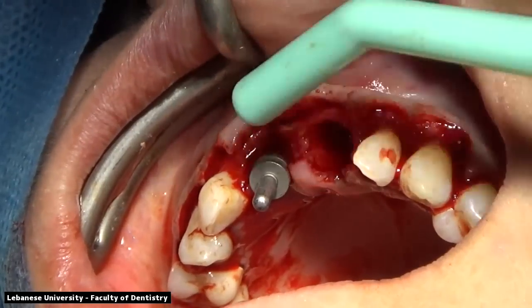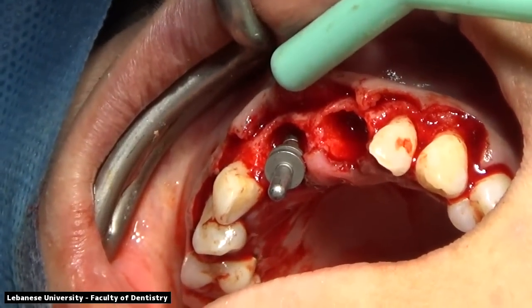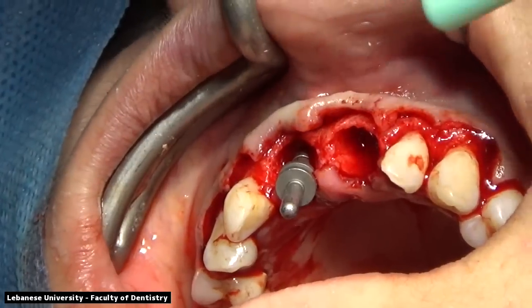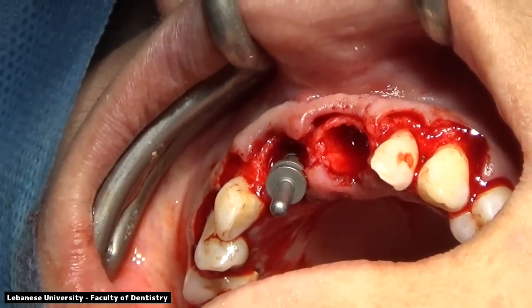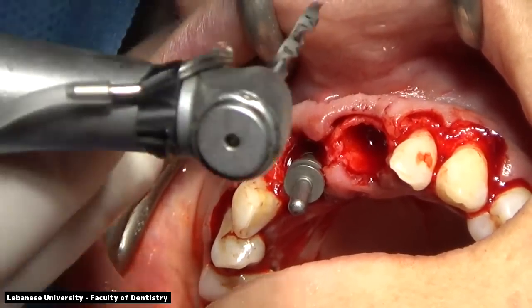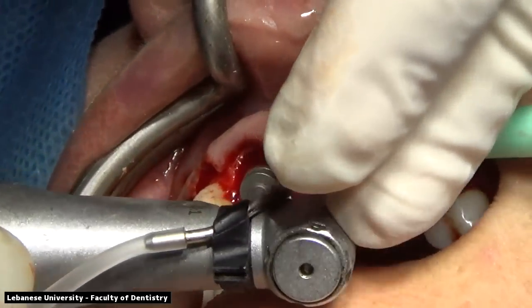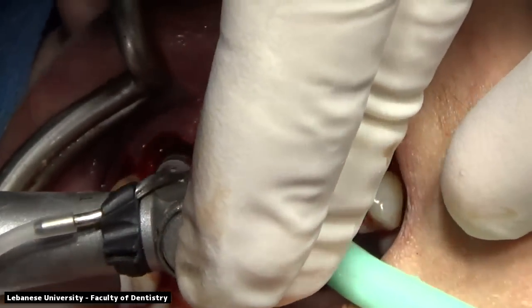Now we're placing our guide again, and we are at the level that we want it to be. It's 13 millimeters with reference from the buccal plate of bone. It's going slightly towards the palatal to get us some engagement and some primary stability, and at the same time it is in line with the neighboring teeth, with the occlusal surfaces, and with the arc of the neighboring teeth.